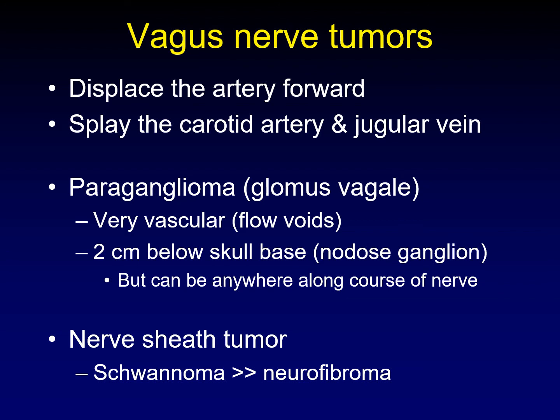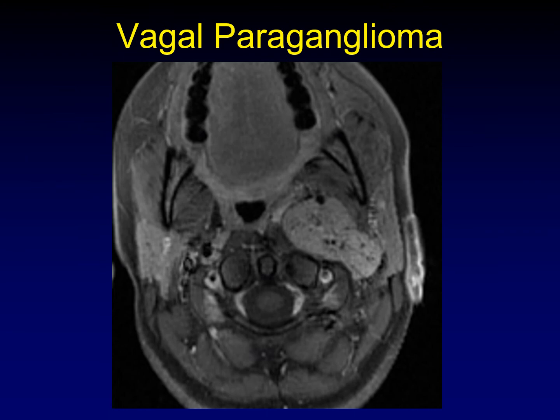This is what a vagal paraganglioma looks like. The internal carotid artery has been splayed away from the internal jugular vein by this tumor, which arose behind and between them. Large flow voids indicate a hugely vascular tumor, characteristic of a vagal paraganglioma. We are right below the skull base at C1, the most common location for this lesion.